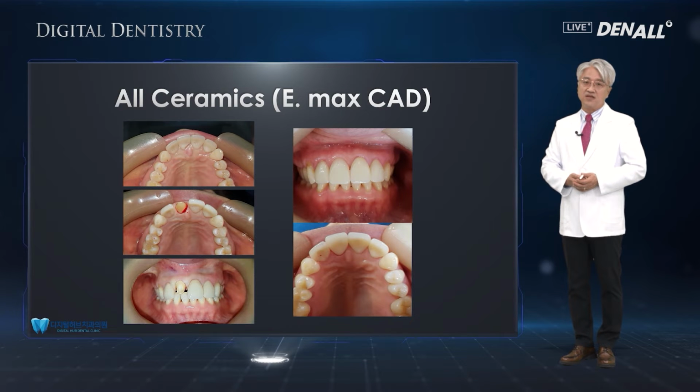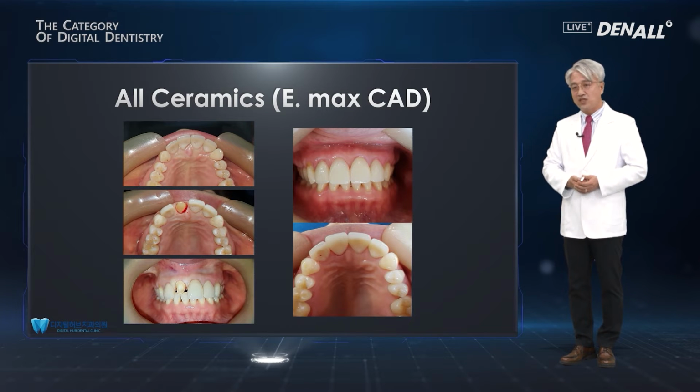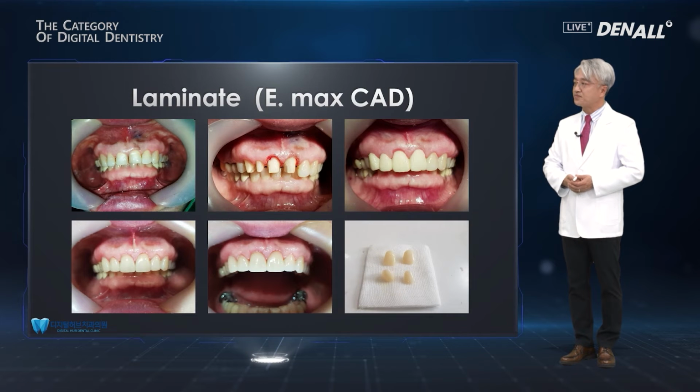In terms of aesthetics on the anterior side, Emax or first generation all ceramics or second generation all ceramics, I think are aesthetically the best. In terms of the satisfaction of the patients, this is also the highest.